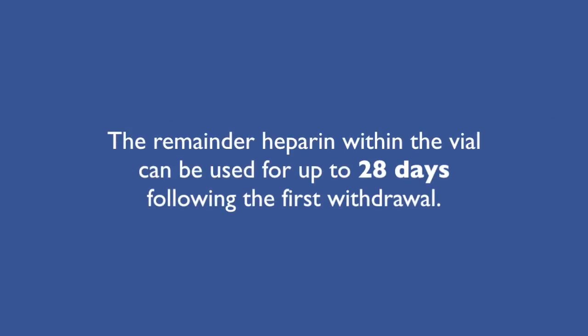The remainder of the heparin within the vial can be used for up to 28 days following the first withdrawal. Please do not refrigerate the vial after opening. And now, you are ready to administer the medication.